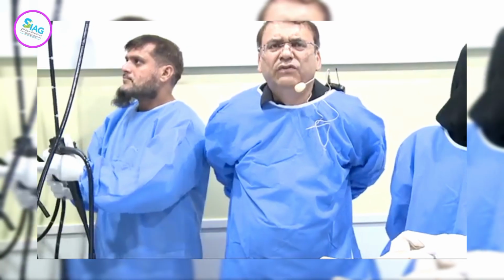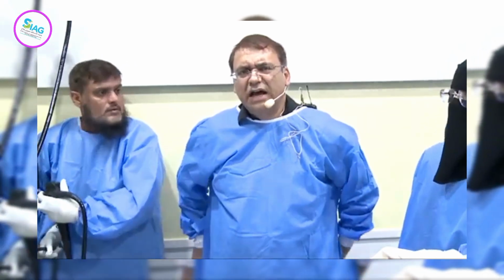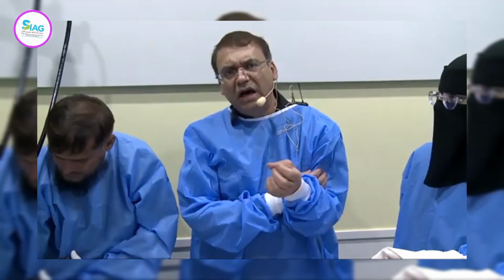Rectal EUS for staging is not used much because I think MRI does a lot better job for rectal cancer staging. But if something needs to be biopsied or drained, it can be useful. Sometimes looking at the fistula could be very helpful.